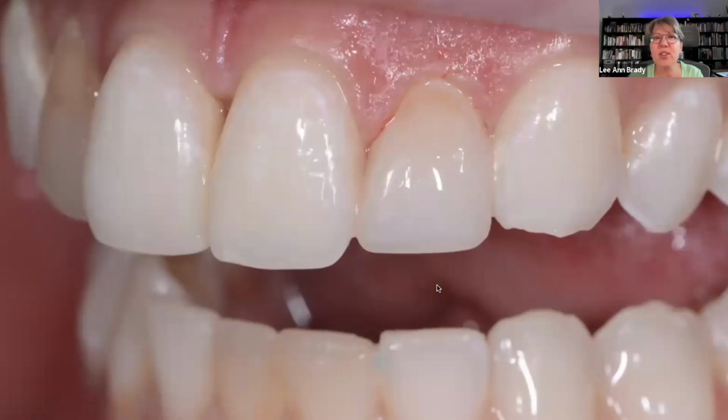Okay. And so if you look, this is the final restoration. This chroma gradient in the gingival third is her natural tooth because my enamel composite is so thin. This translucency, just like in her natural tooth, is because my incisal edge is pure enamel composite with no dentin. You can see where I ended the dentin composite there because it's more opaque.